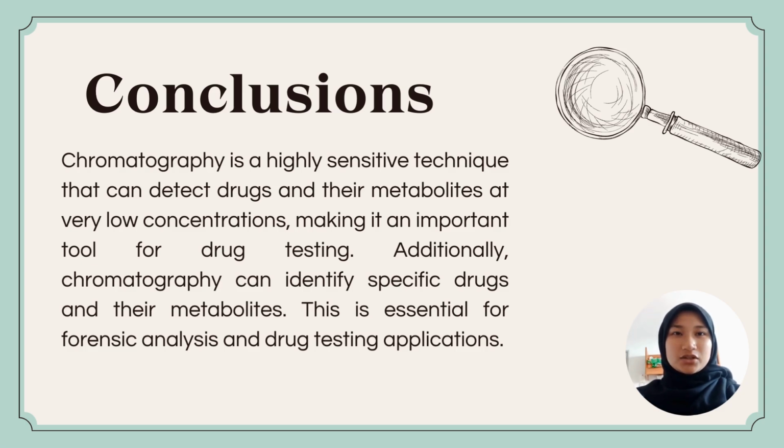This makes chromatography vital not only for detecting illicit drugs, but also for therapeutic drug monitoring and forensic toxicology. Its ability to deliver accurate and rapid results ensures that drug testing is reliable and effective, safeguarding public health and ensuring proper therapeutic management.